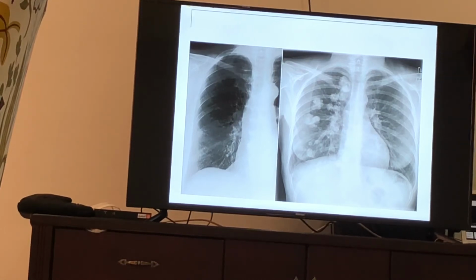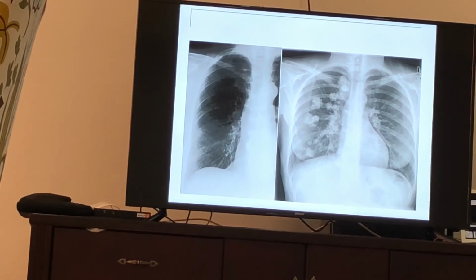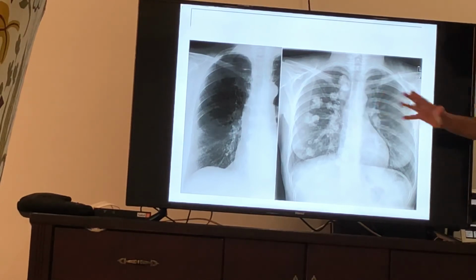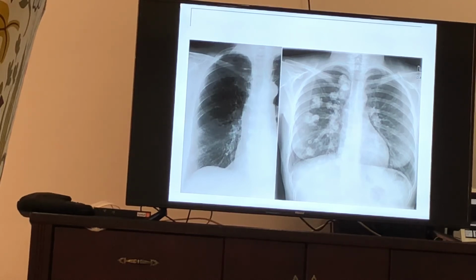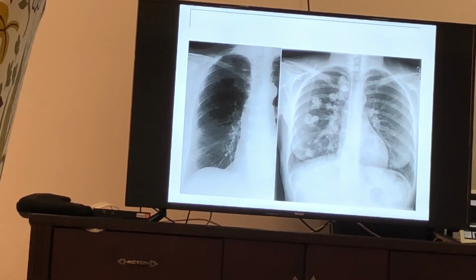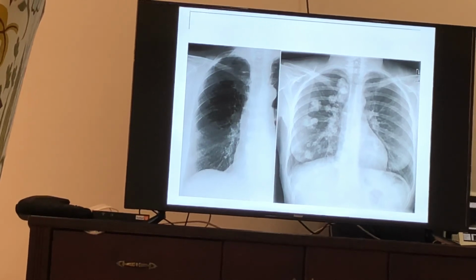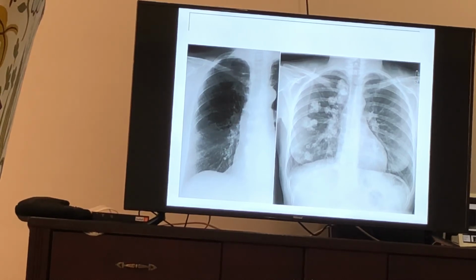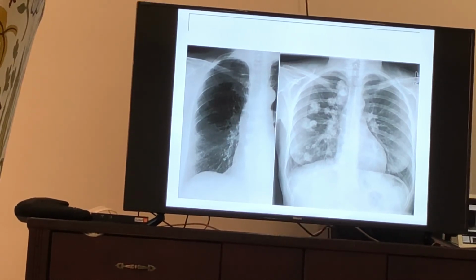What was the case here? This is also metastatic with calcification, on the right side. This one is also metastatic but most likely coming from a germ cell tumor, like choriocarcinoma or one of those. They spread by blood more; usually we see those with blood spread.